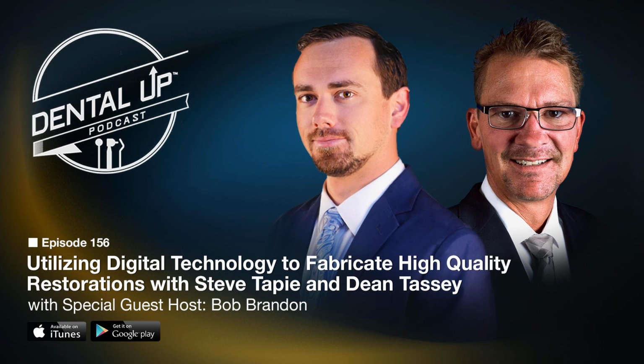The only caveat to that is that it is not as strong as the full strength Bruxer. Roughly about half as strong, if I'm not mistaken. Yeah, it's the old trade-off in dentistry: strength versus aesthetics. Right. As aesthetics increase, strength generally goes down. But I think this is a very nice happy medium, a happy blend between the two.